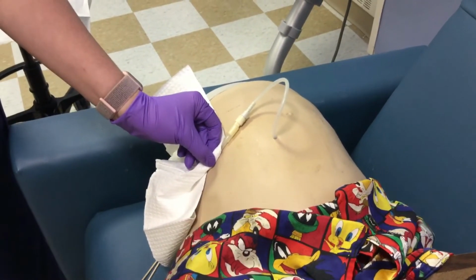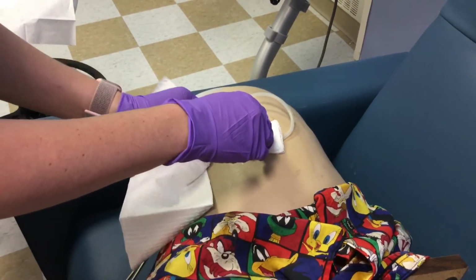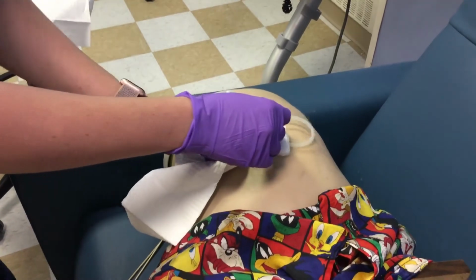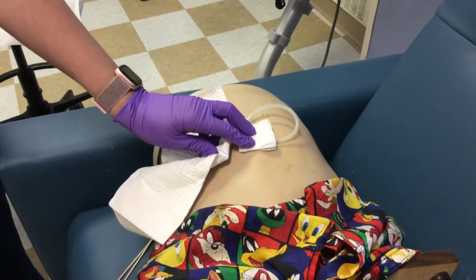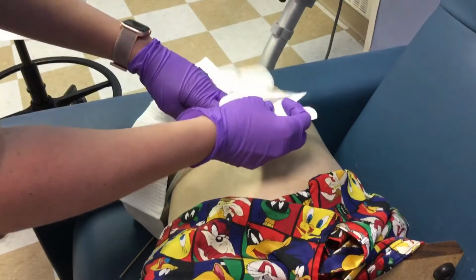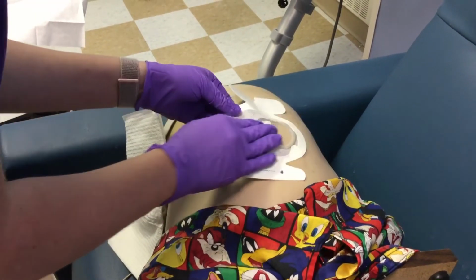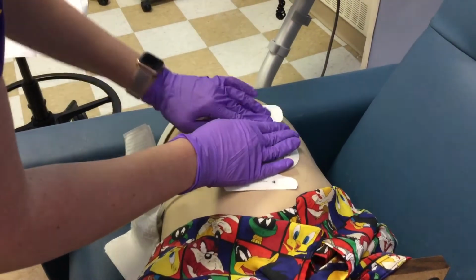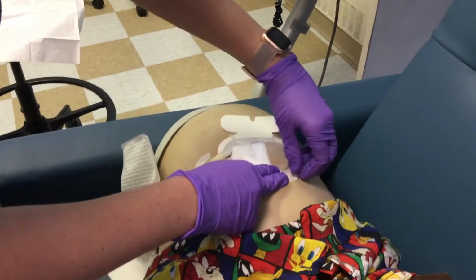You will then cover the site with your 2x2 gauze that you placed on your sterile field. And then cover the insertion site with your Tegaderm. You'll then remove the outer layer.